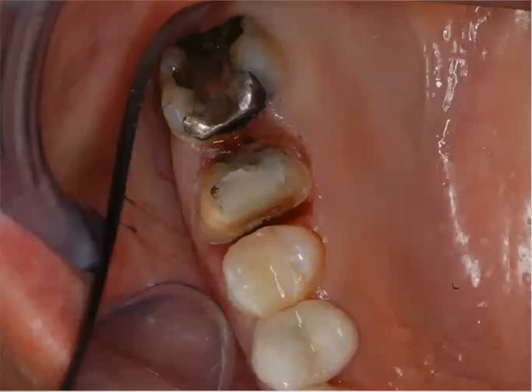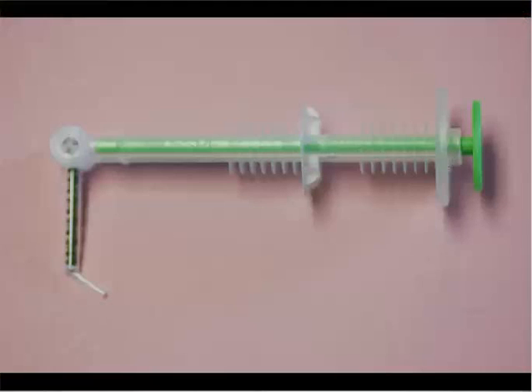Once we do our preparation, I won't get into all the minor details of that, but we've replaced the amalgam with a base. This base is Vitrebond Plus, an RMGI type of base, light cured, wonderful, really decreases any potential symptoms down the road. So now we've done our preparation. Our tissue is free from contact on the prepared tooth. Now we're able to go ahead and take this.